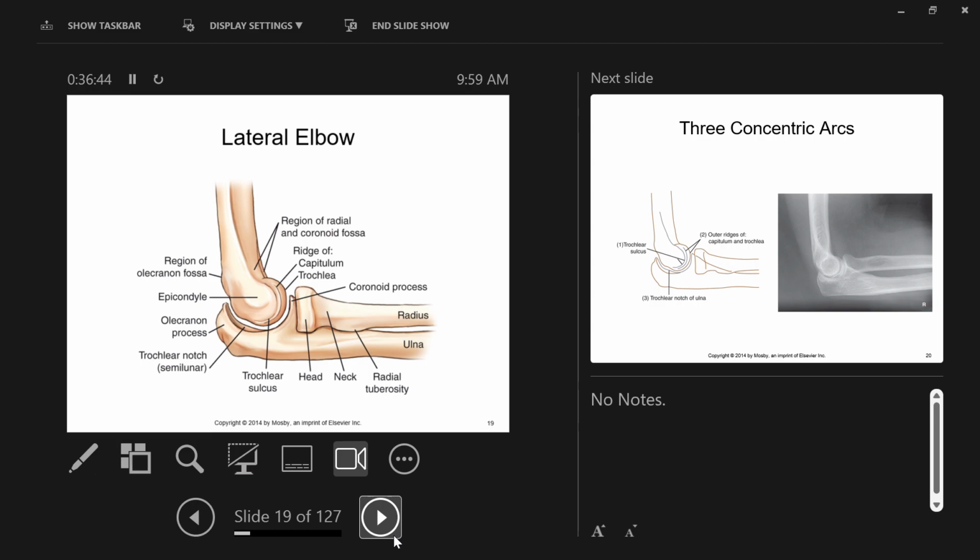I can raise the image receptor, right? Now, I don't want to use pillows or anything wonky to raise the image receptor. Maybe our radiographic sponges, right? Use those. Those are pretty stable. That's a really good idea. But then, let me give you a but-then statement. But then I am now bringing the image receptor closer to the X-ray tube, right? And we have a source to image distance we're trying to maintain, right? So what's that distance, by the way? 40 inches, right? 100 centimeters. So I can raise my X-ray tube up, yeah? However much I raise the image receptor, let's lift the X-ray tube up that much.